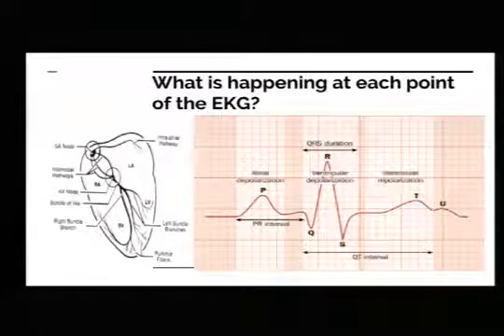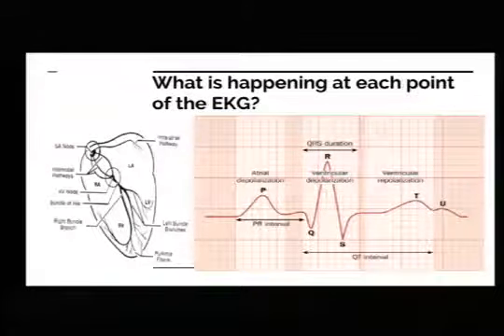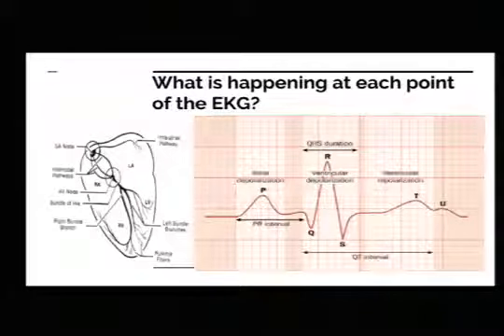And here's kind of a depiction of what's happening electrically at each point in the 12 lead. So you think about why you get a long QRS: it's taking the ventricle longer to depolarize and get through that entire ventricle, like in a left bundle, right bundle, longer to move down that electrical conduction system because there's a block somewhere. So it has to go not through the normal pathway, but through the myocardium itself and not on the electrical circuit. And that U wave, I don't know if any of you have actually seen a patient with it. You'll see it in hypothermia and some electrolyte abnormalities sometimes.